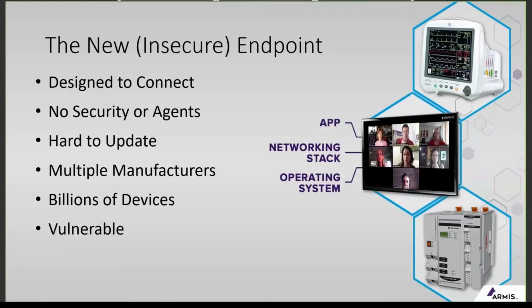When we look at devices in an environment, and very much in a healthcare environment, we break them into two categories, managed and unmanaged. Managed are the traditional IT devices that, to be honest, IT's managed for decades. These include laptops, mobile devices like tablets and phones. And on these traditional devices, they've got an operating system like Windows or Android or iOS on an Apple device. They've got software that allows users of those devices to do the things that they want to do, but they also have software that's used to connect these devices to networks, other devices, etc.